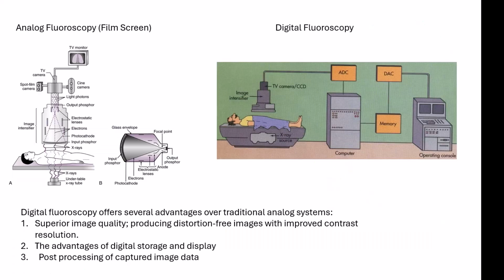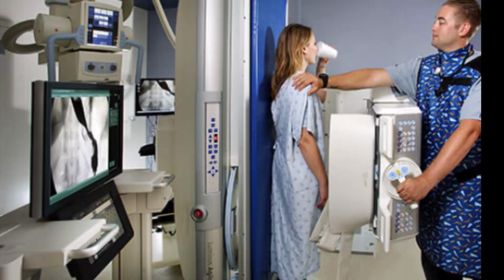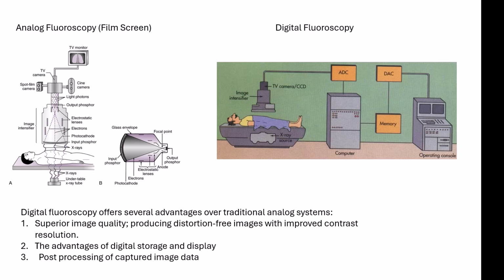Digital fluoroscopy and analog. Analog or film screen fluoroscopy has basically been replaced by digital fluoroscopy. The reason for this is digital fluoroscopy offers several advantages over the traditional analog systems. These include superior image quality, producing distortion-free images with improved contrast. There is also the availability of data to be stored, displayed, and post-processed utilizing a digital system.